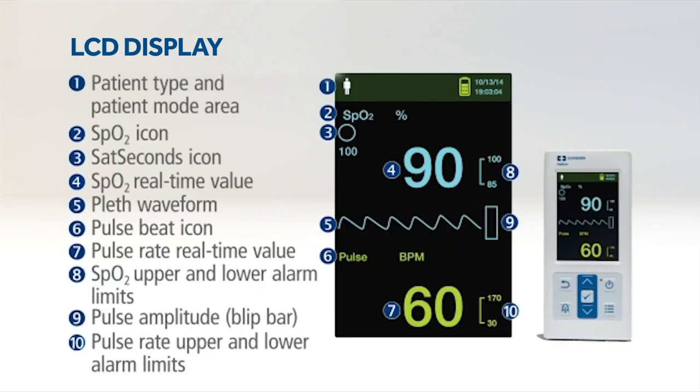The vivid three-inch color LCD screen supports a robust data set, including real-time SpO2 and pulse rate values, Nellcor SatSeconds alarm management, a pleth waveform, blip bar, and tabular trend data.